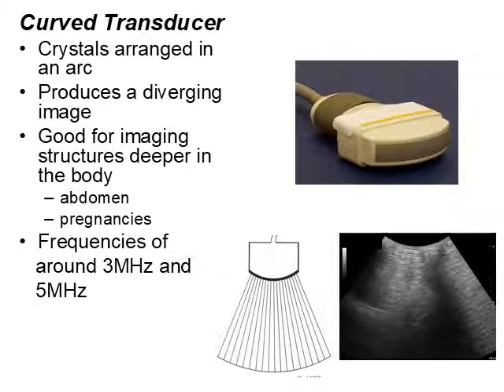Now, the next most common transducer you come across is a curved transducer. So you can see the difference in this transducer here. Instead of being flat, it does have a curve on it. So it sticks out more anteriorly here and sort of comes around on the sides here. To get this side part in contact, you actually have to push down into the skin and actually make that whole surface of the transducer in contact with the skin.